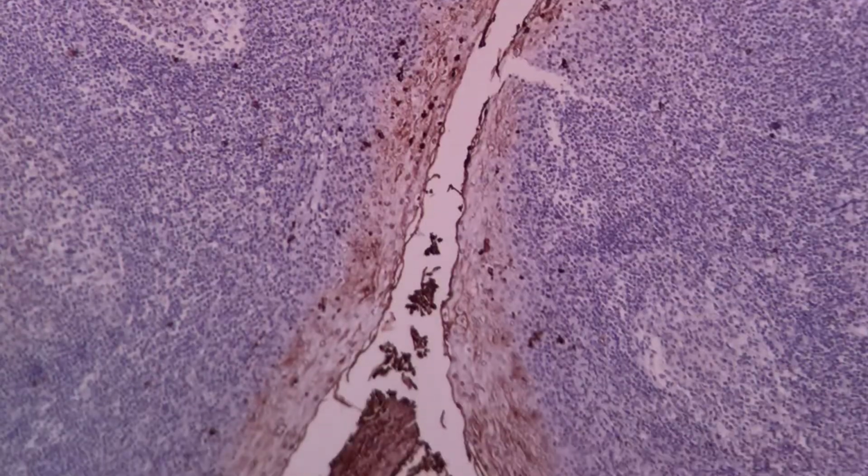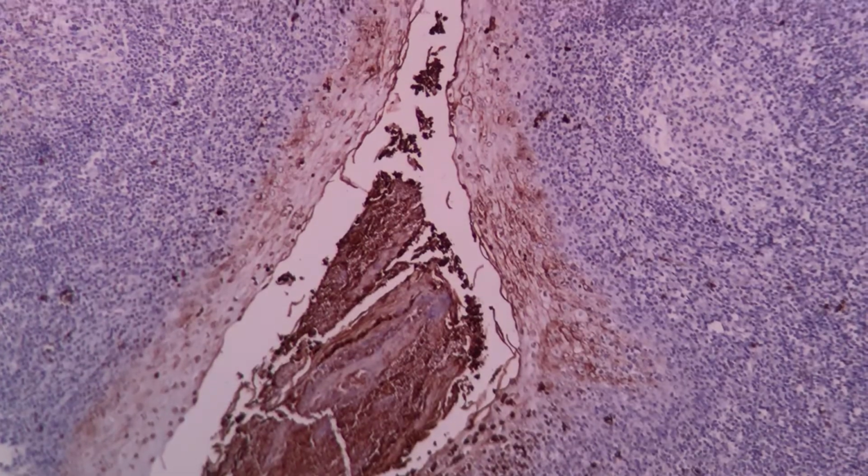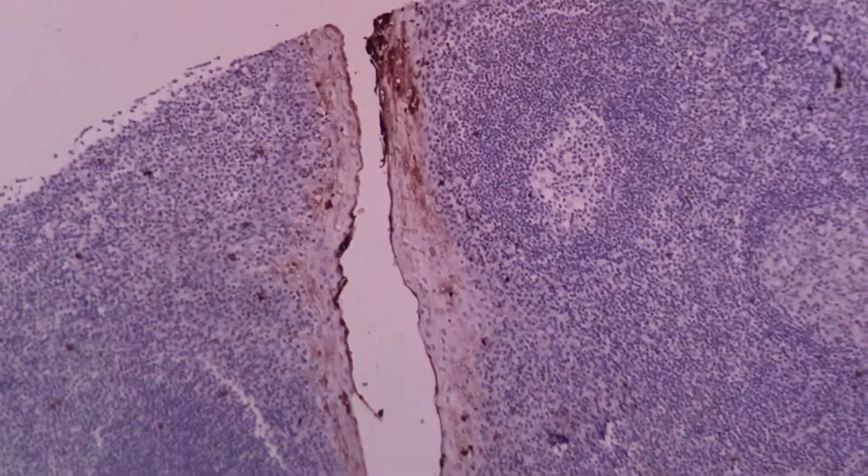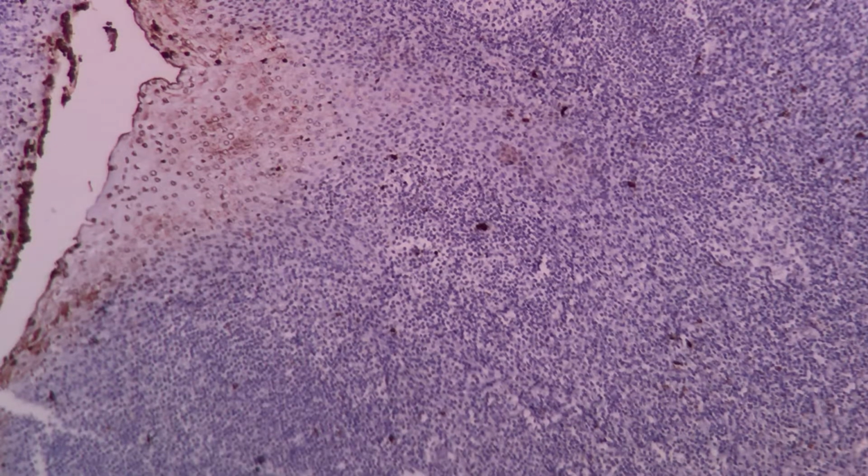The epithelium has also got faint staining. That is because of the constant interplay of granulocytes in that region, and that is considered an acceptable staining if a participant has got that thing in their staining.